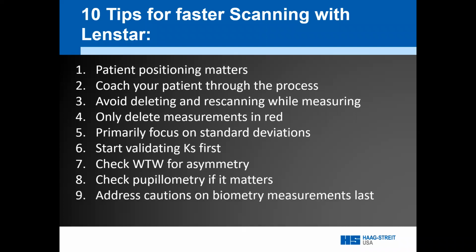Number 9, address cautions on the biometry measurements last. Once you move those gates in the biometry section, the measurement session closes. And if you want to take just one more scan, you'll actually have to start a whole new measuring session instead. Number 10, default your most used template. That way, when you're ready to calculate, your most used template will auto-populate, saving you from a couple extra clicks.